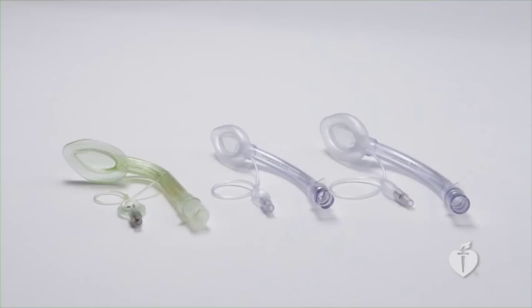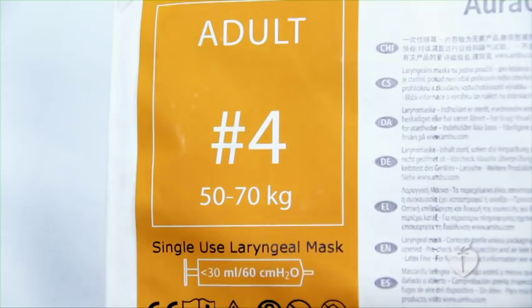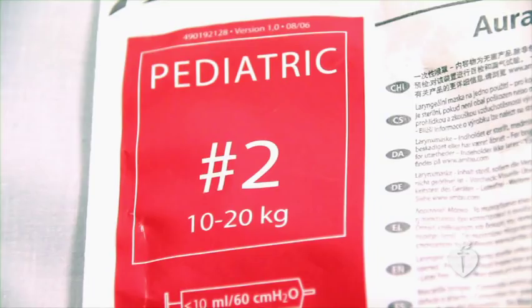The correct size is based on the patient's weight. Weight ranges appropriate for each airway are printed on the package, on the device, or both. For example, use a size 2 laryngeal mask airway for a child who weighs 10 to 20 kilograms. The maximum amount of air recommended to inflate the cuff is also noted on the package and the device.